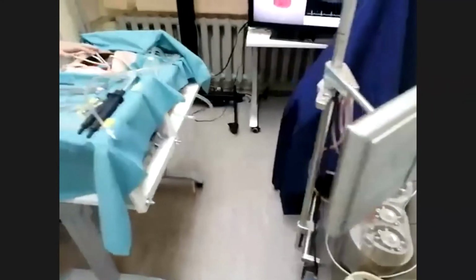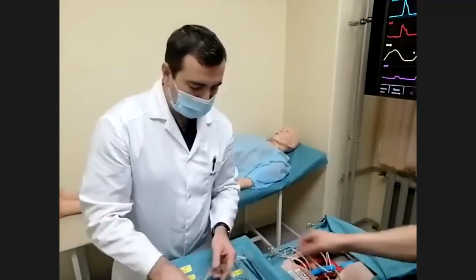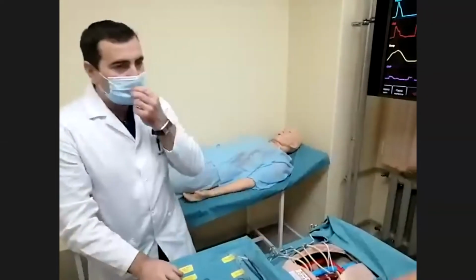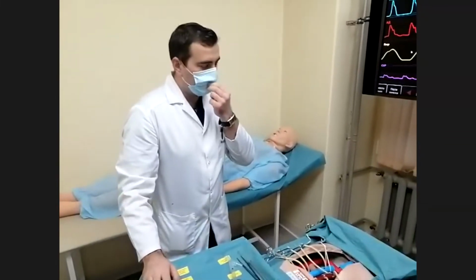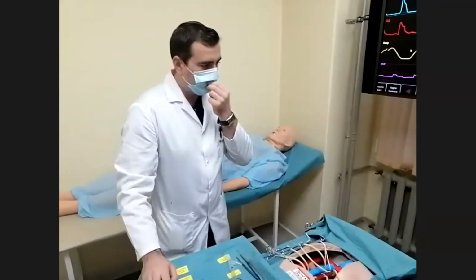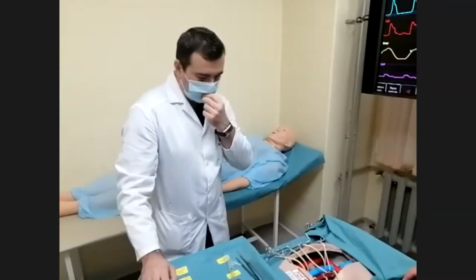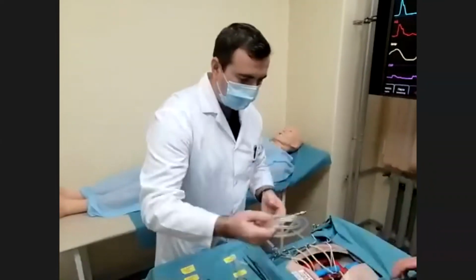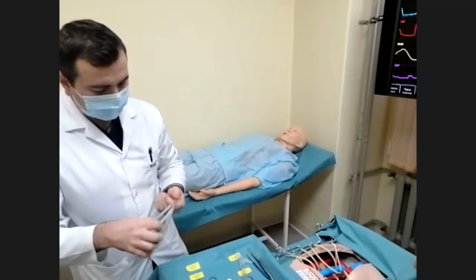Okay. So on my side, I think the questions would be about consumables, about how this is used in day-to-day operations, how this can be used for accreditation and this kind of stuff. So can anybody else add? If not, I think we can just go one by one over these questions. Okay, so let's start with the first question. Sergey Sergeyevich, could you please tell us if there are consumables for this task trainer?